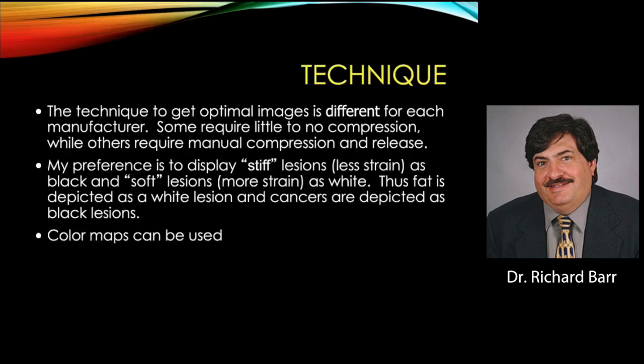And the technique to get optimal images is different for each manufacturer. Some require little or no compression, like the Mindray system, while others require manual compression and release. So in some systems, you may have seen that you have to move the transducer up and down a millimeter or two to apply that force.